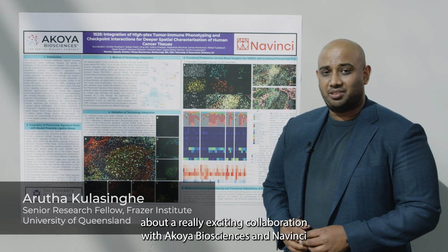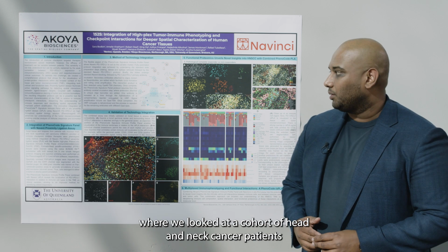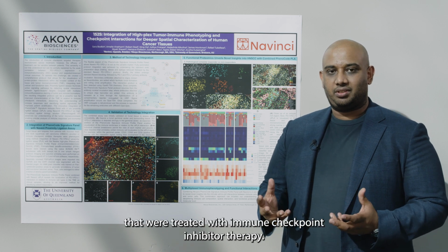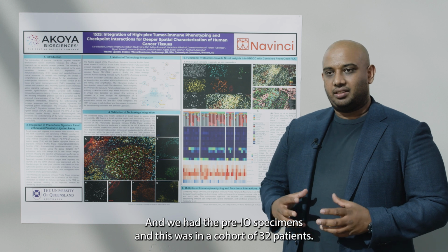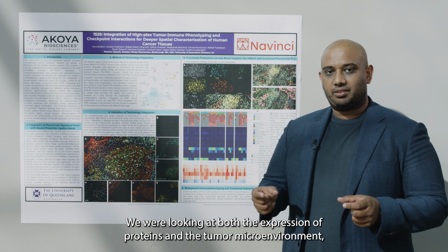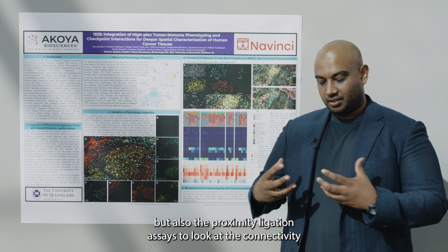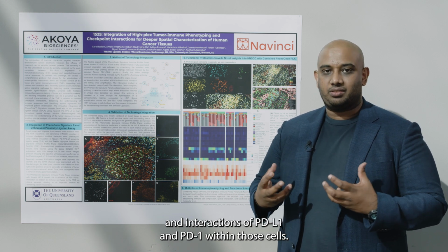Today I'll be talking to you about a really exciting collaboration with Akoya Biosciences and Navinci, where we looked at a cohort of head and neck cancer patients that were treated with immune checkpoint inhibitor therapy, and we had the pre-IO specimens. This was in a cohort of 32 patients where we were looking at both the expression of proteins and the tumor microenvironment, but also the proximity ligation assays to look at the connectivity and interactions of PD-L1 and PD-1 within those cells.